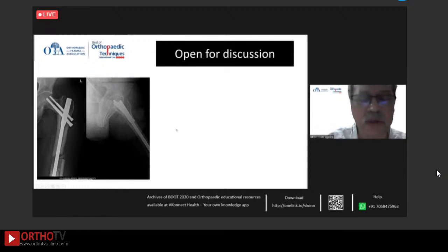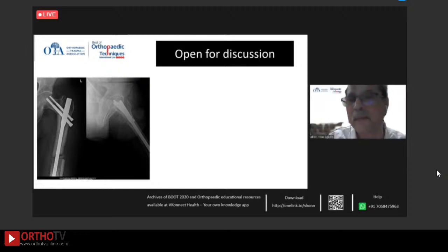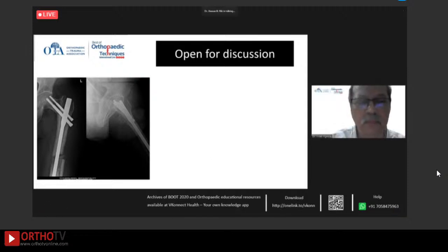May I invite suggestions, Dr. Vivek, Paul, and Dr. Mir, and Dr. Malhotra? Any suggestions? Yeah, so I would revise this, I would re-nail it, but I would do an open nailing.